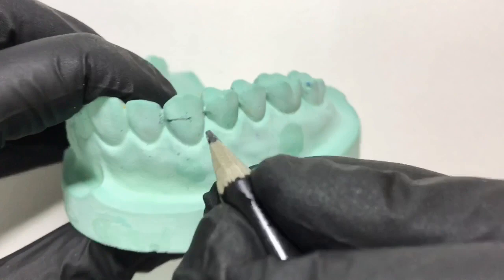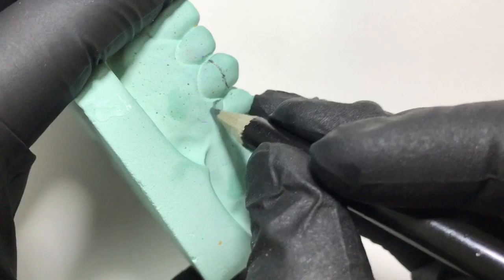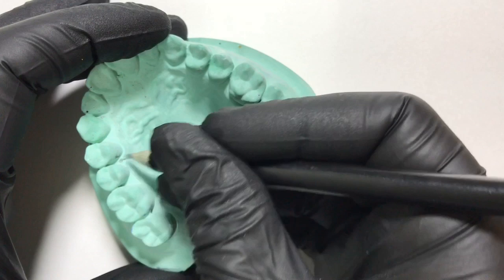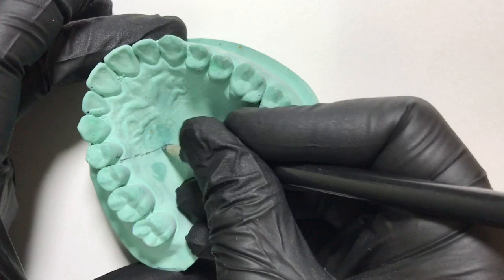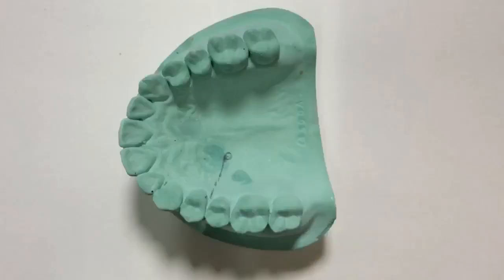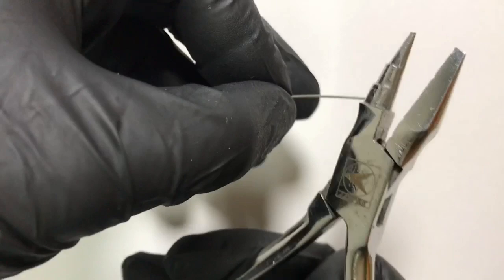We will begin with marking the active arm, which will follow the middle third of the canine. As you can see, this is the active arm following the contour of the canine at the middle third, which is followed by a u-loop falling just 2 to 3 mm below the premolar. It will then go into the distal embrasure, followed by a retentive arm and the retentive tag.